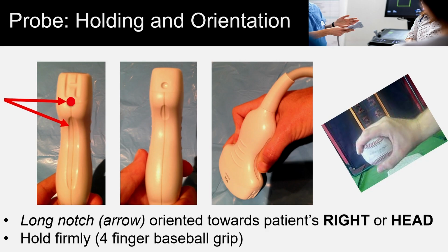It requires a little bit of pressing into the human body, so don't just place it superficially. Give it a little bit of a push, until the patient says, oh, that is hurting or something, then you can back off. But it does require good contact with that gel.